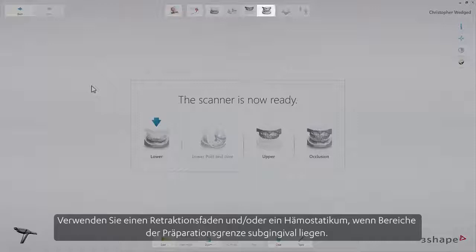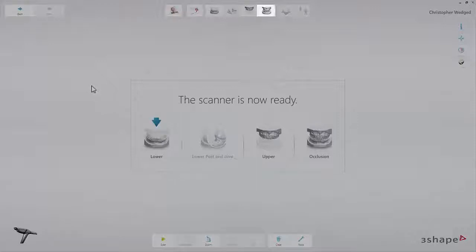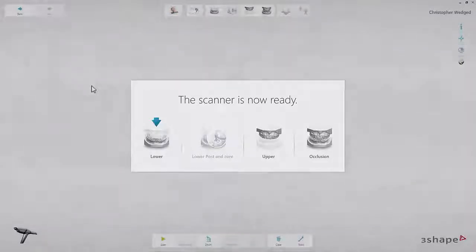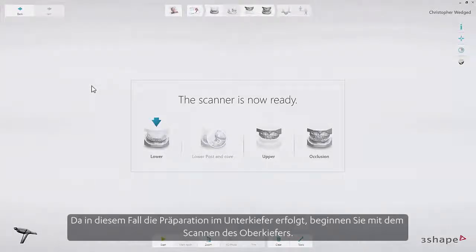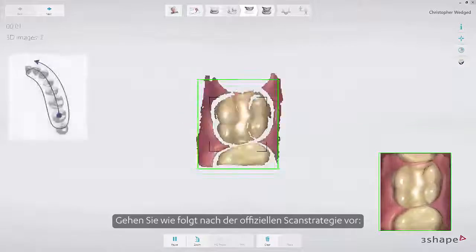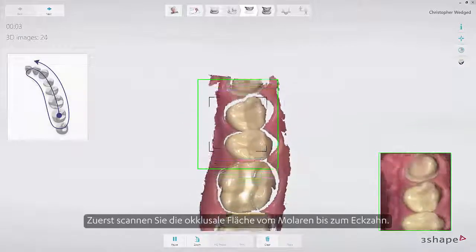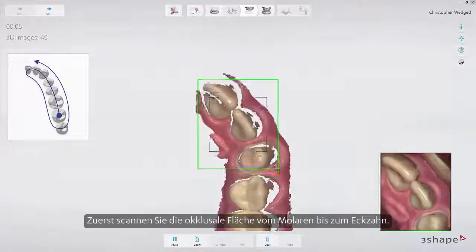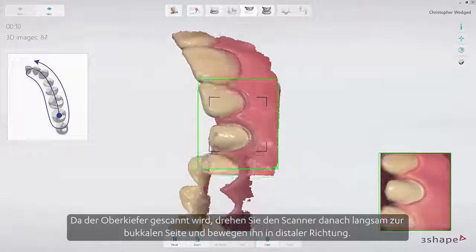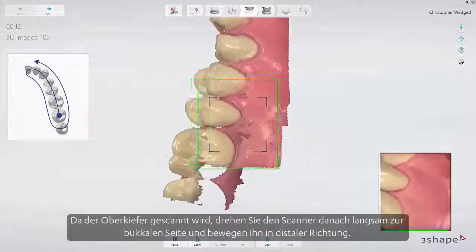Firstly, use retraction cord and/or hemostatic agent if parts of the margin are subgingival. In this case, start by scanning the opposing arch to allow time for the retraction methods to take effect. As the preparation is on the lower arch, start by scanning the upper arch. Follow the official scan strategy: start by scanning the occlusal surface from the molar to the canine. Then, as it is the upper arch, slowly roll to the buccal side and move the scanner in the distal direction.